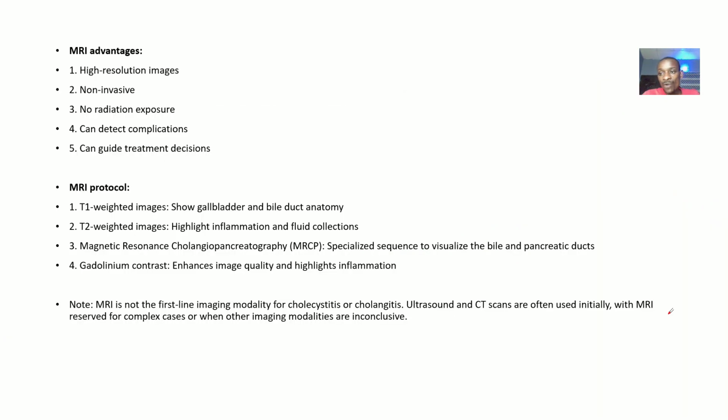So why are we using MRI scan for this? Advantages of using MRI: you could have high resolution images. It's a non-invasive method, so you don't need to cut through the patients so they feel pain, or apply anesthesia and all of that. There's no radiation involved. It can help you detect possible complications or an existing complication. It can also help guide your treatment decisions. You know the level at which the disease is, and you know how vigorously you need to take up the treatment.